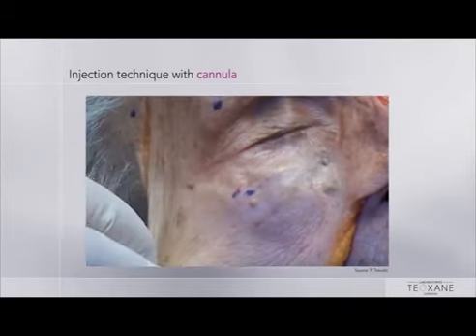On this cadaver, we can see the mid-cheek ligament marked with a blue dotted line. The removal of superficial fat enables us to see the colorful hyaluronic acid located deeply beneath the orbicularis oculi muscle. When we apply pressure on the product, we can see that it is contained in a delimited area. It is therefore important to inject deeply in order to prevent migration of the product.